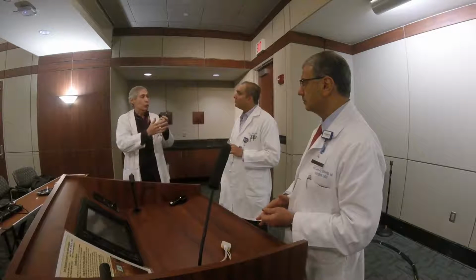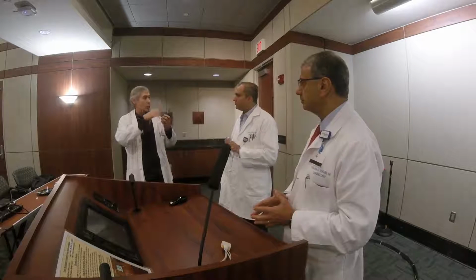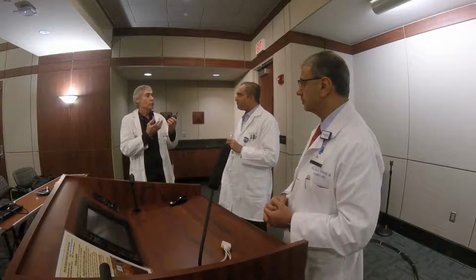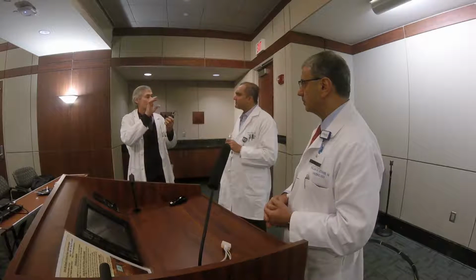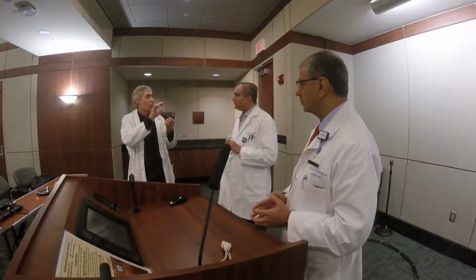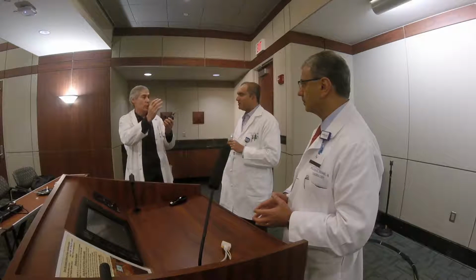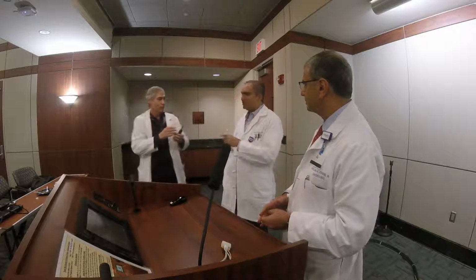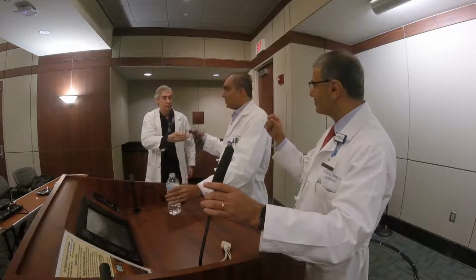In nuclear, we always talk about looking at not only whether it's viable, but also the percent of the absolute myocardium that's viable. What data are there in CMR looking at what percent of the myocardium has greater than 50% hyperenhancement as a cut point to be able to say, you shouldn't send this patient for surgery, let's say? Yeah, how do you quantitate the extent besides thickness? Yeah, so that's a good comment.